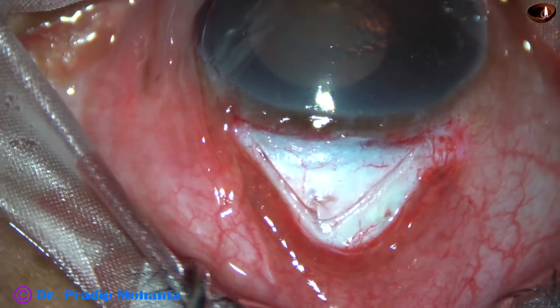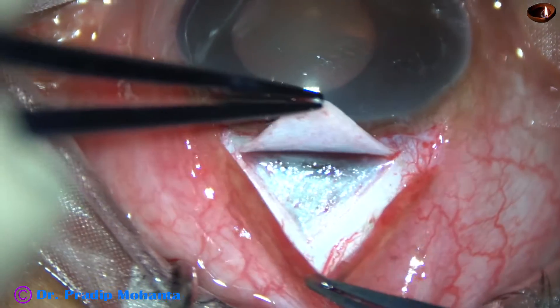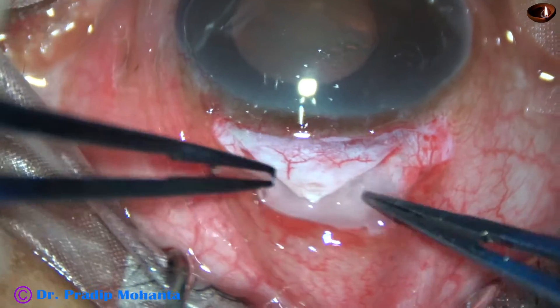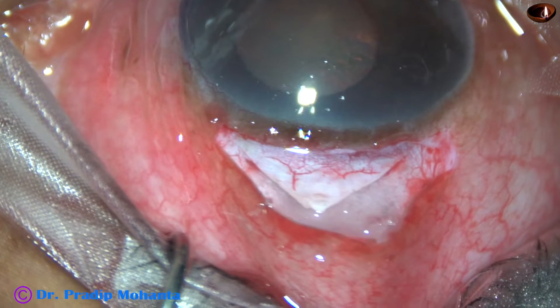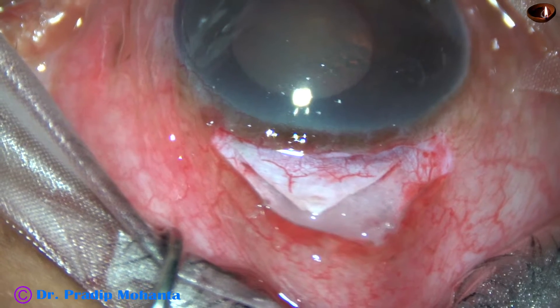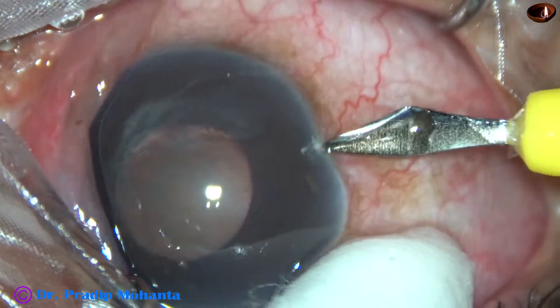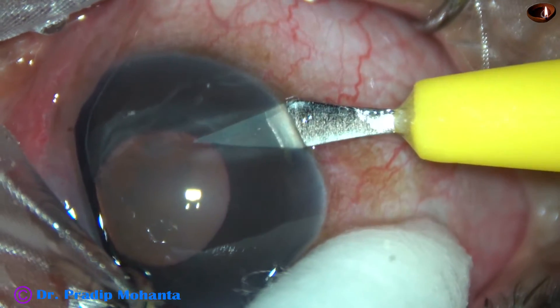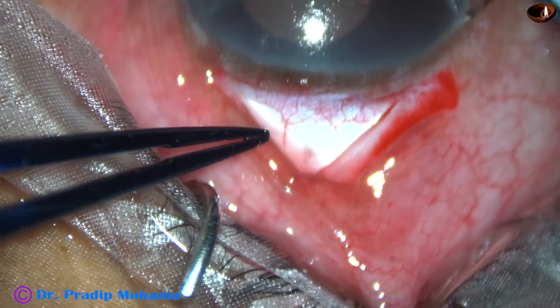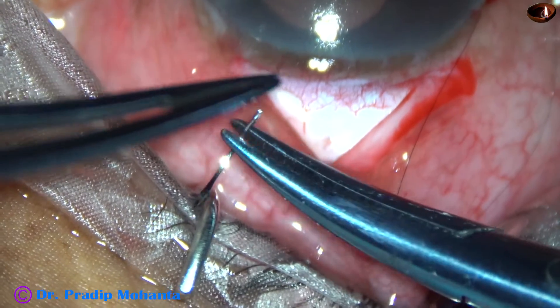Now I am going to use a mitomycin C-soaked cotton ball, keeping it here for about one and a half minutes. Now I make this side port. After removing the cotton ball and washing the area.